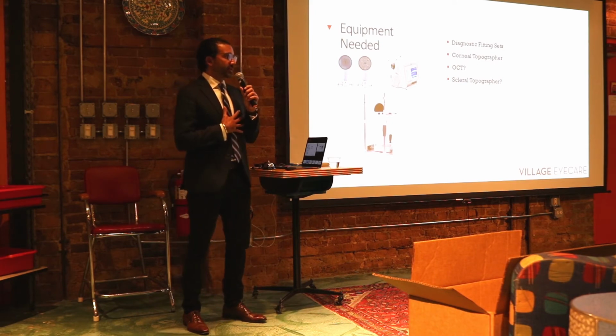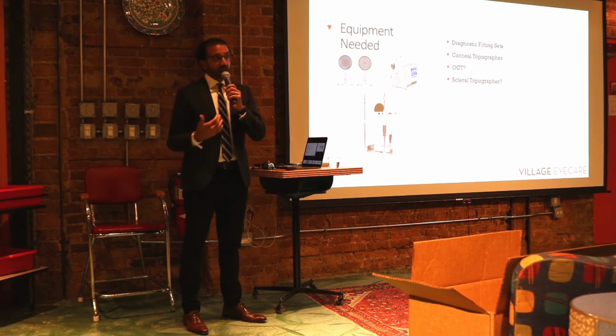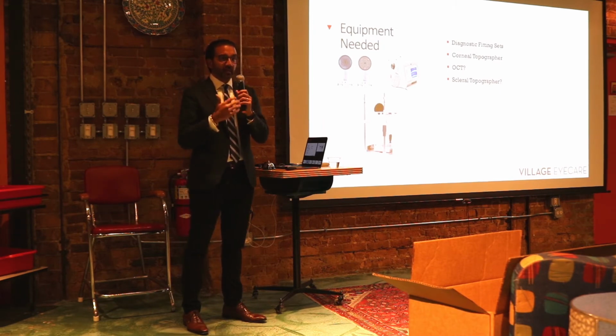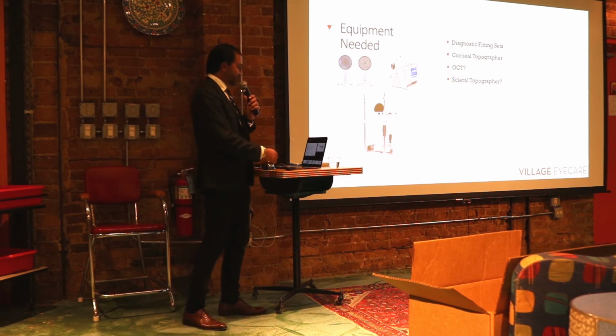My recommendation would be to pick a lab that you're comfortable working with, pick one lens design, and get really good at it. Learn what the terminology is for that design, learn what parameter changes translate over to the patient, and over time you will build your confidence with that design, and over time you can then expand to other designs.